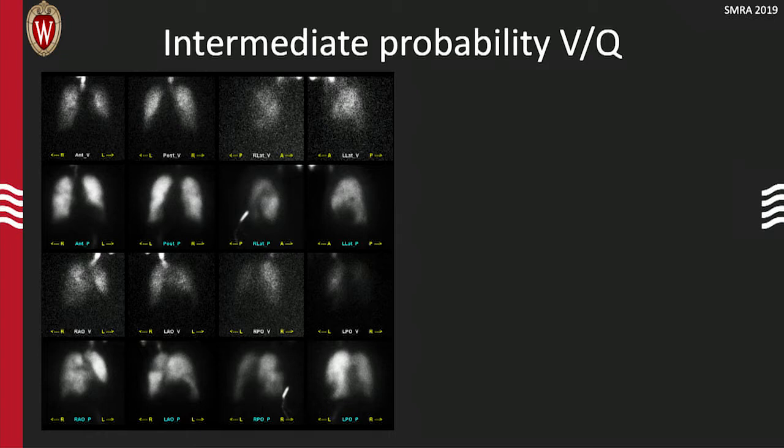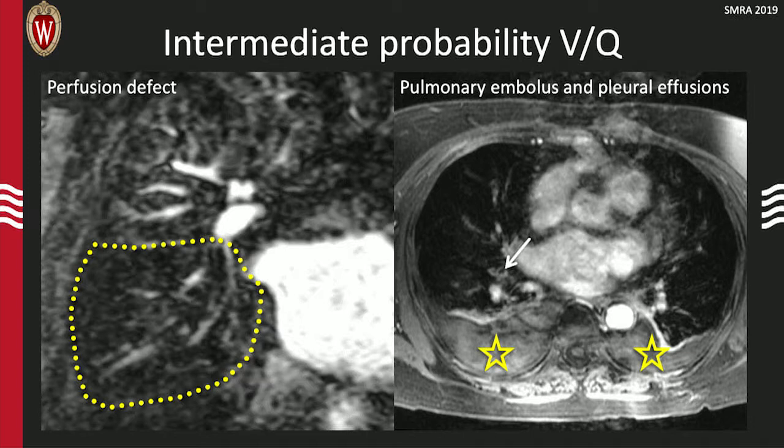Whereas many institutions do have CT techs, or now more and more MR techs that do work 24/7. So MR represents a very nice alternative in these patients to get an answer very, very quickly, and when CT is not an option.